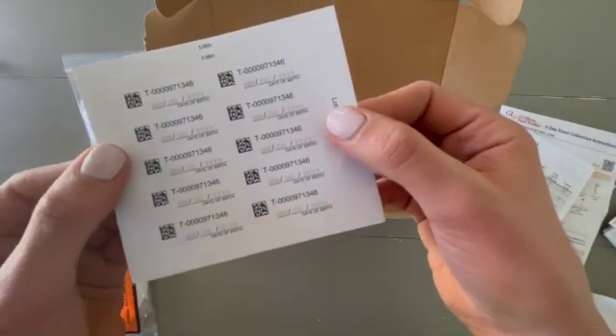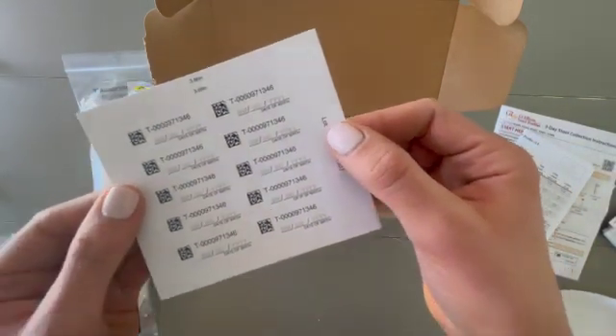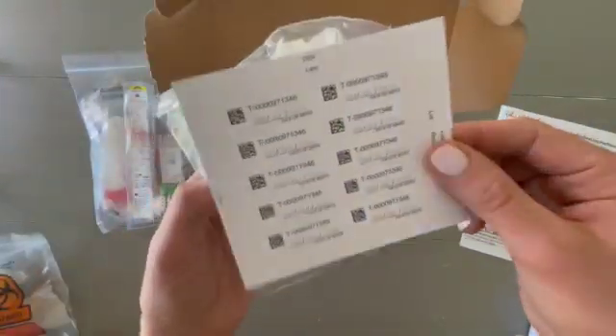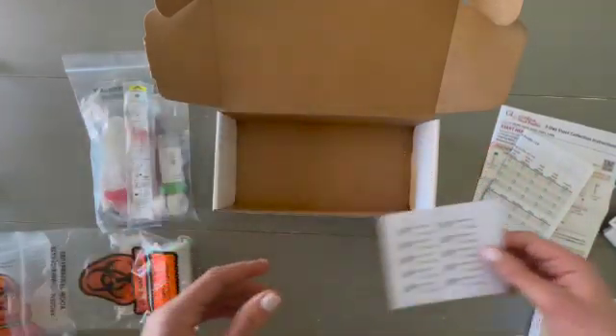You'll find these little labels — this is just helpful to keep track of everything. You'll put your date of birth on them and each label will go on a vial, just in case anything gets separated so they'll have a tracking reference for it.